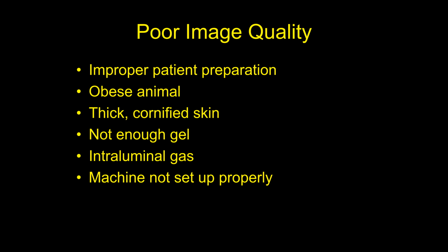Gas. Ultrasound does not penetrate through gas. Okay, it doesn't penetrate. If you hold an ultrasound probe to the air, you won't see a damn thing on your machine. Okay, something that high frequency won't penetrate through air. And so again, if I put it in the abdomen and I find the stomach, if the stomach's full of gas, I can't see anything in the stomach. Ultrasound will not penetrate through gas. I can't see anything through gas. Okay, you can't use ultrasound really to look inside the lung because the lung is full of air. Okay, radiographs you would use. Okay, so ultrasound, if you have a lot of gas in the belly and the small bowel, it's going to inhibit the ability to do ultrasound because you have a lot of gas inside the bowel.